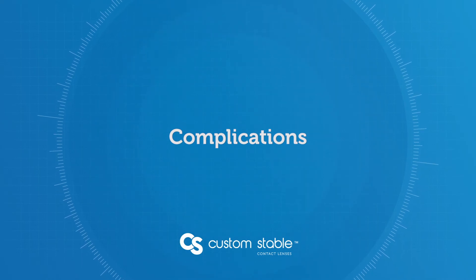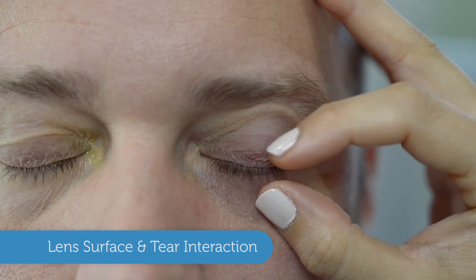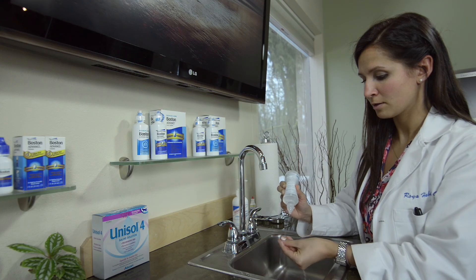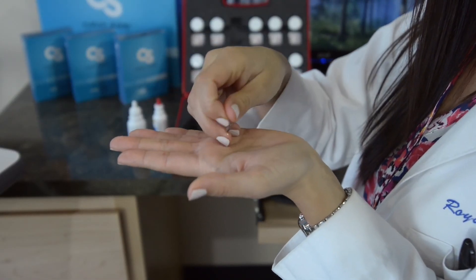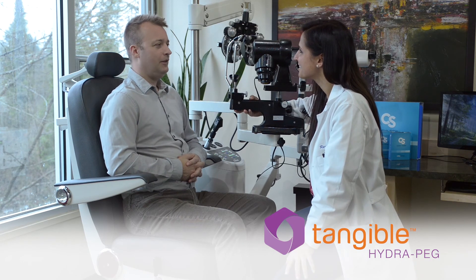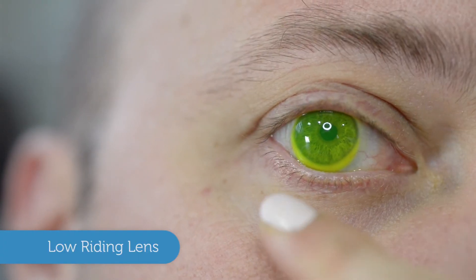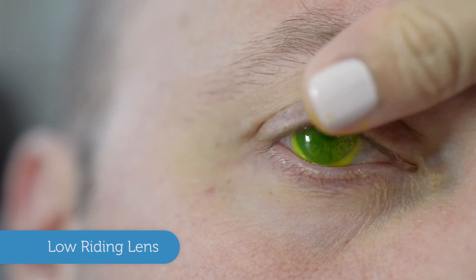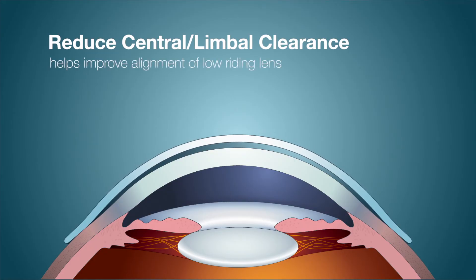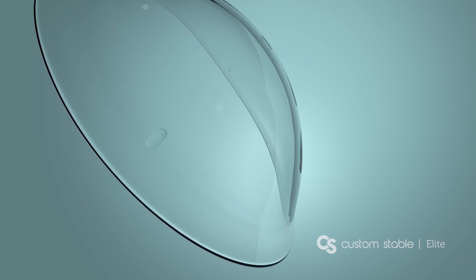There are a few common challenges when fitting the Custom Stable lens, the first being lens surface and tear interaction. The most common cause is a lack of preparation on the surface of the lens — cosmetics and lipids on the eyelids can also be a factor. To avoid this, prepare the lens well with solution and use a lid scrub on the patient if necessary. Custom Stable lenses can also be ordered with Tangible HydroPEG, a breakthrough lens coating that increases surface water retention, lubricity, and smoothness while minimizing deposits and lens fogging. Another complication is the lens riding slightly low — if clearance is too high over the limbus or centrally, it can cause the lens to ride low. Reducing central or limbal clearance can help, as can fitting the Custom Stable Elite, which is more adept at centering on toric scleras.